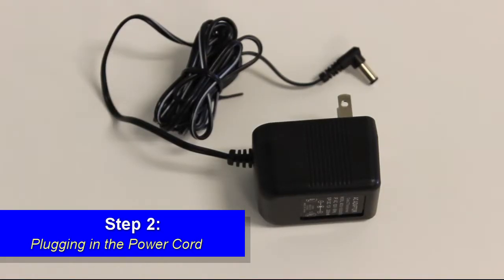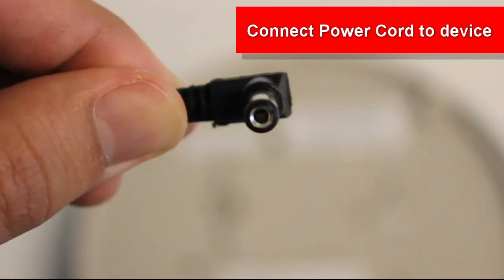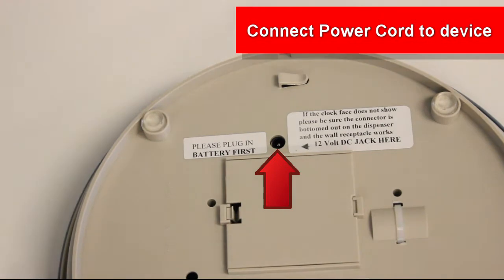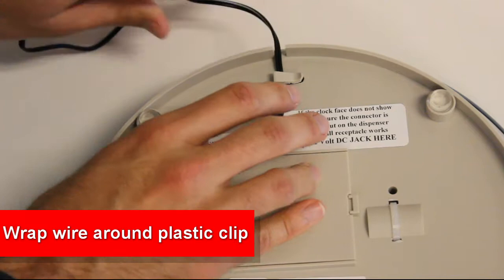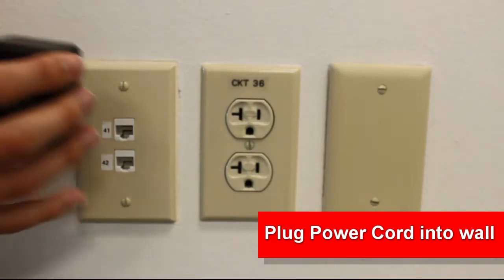Step 2: Plugging in the power cord. Connect the circular end of the power cord into the back of your device. Look for the small hole above the battery lid. Wrap the wire around the plastic clip and pull through the small opening. Plug the power cord into the wall.